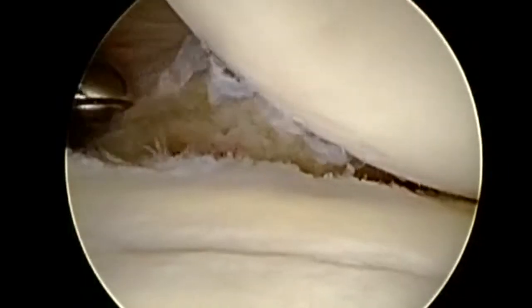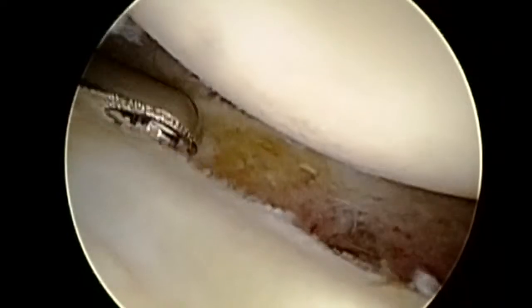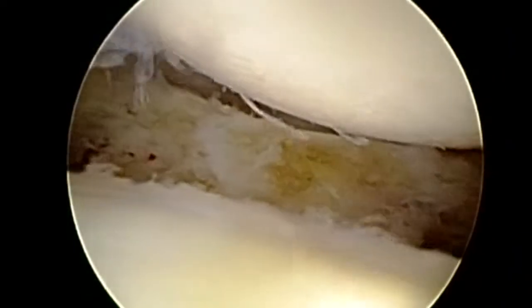She actually lacked internal rotation in abduction. She had approximately 20 degrees of internal rotation, and she had trouble getting her hand above T10, and so we also performed a posterior release.